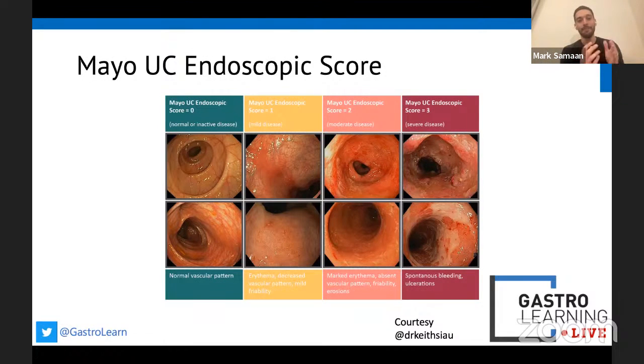If you're doing endoscopy, I think you should have this score in your head, mainly because it really isn't that taxing. And I think we tend to understand that patients with Mayo 2, erosions, or Mayo 3, ulceration, kind of need escalation or a change in their treatment, and that's all you need to know. If you don't practice IBD medicine regularly, that's fine.